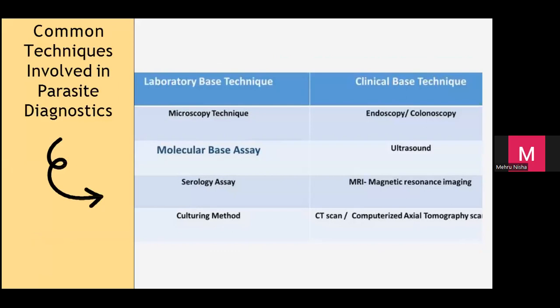So now we go directly into the main topic of discussion today: common techniques in parasite diagnostics. If we are more into laboratory science, even my PhD was more lab, we will be more familiar with microscopy technique, molecular assay, serology, culturing method. These are all scientist work. We are the scientists. So diagnostics has two types.